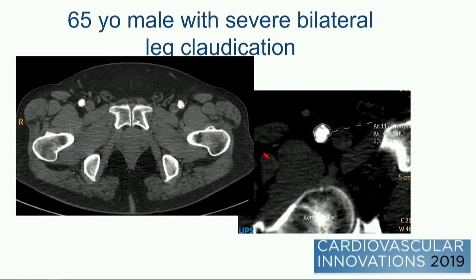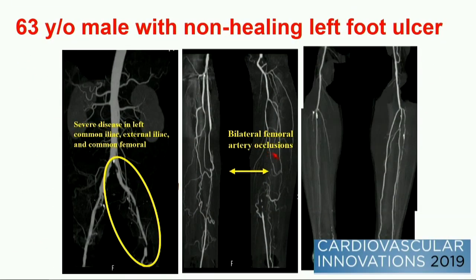You see this particular patient you want to treat. The CTA showed you really dense calcification in the common femoral artery. That patient went to surgery and endarterectomy.